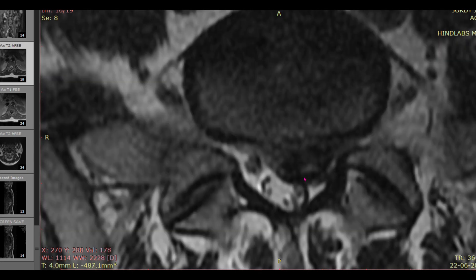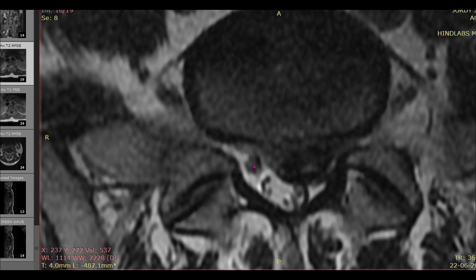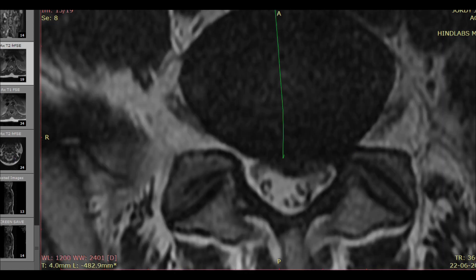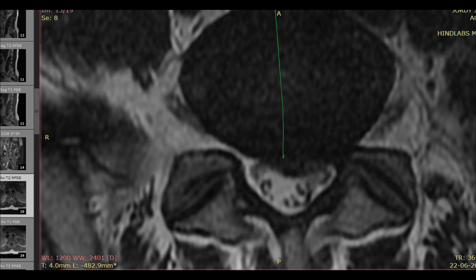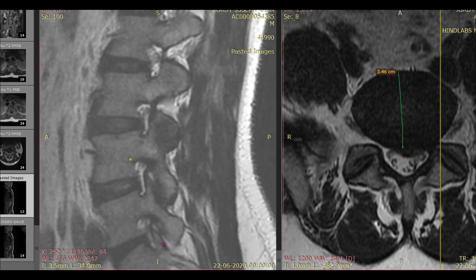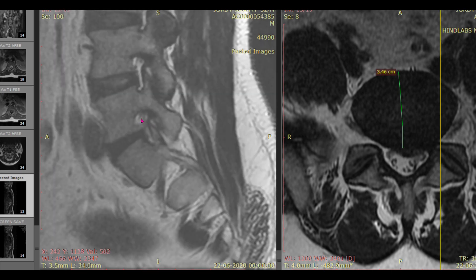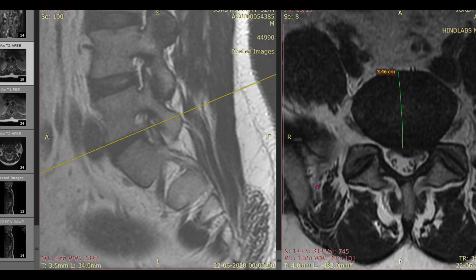At the L5-S1 level, there is a disc protrusion causing severe compression of the traversing nerve root on the left side. You can faintly see the traversing nerve root on the right side as well. The left traversing nerve root is compressed and posteriorly displaced by the disc. For the exiting nerve root, always rely on the sagittal images. In this case, the exiting nerve root on the left side, occupying the upper portion of the foramen, appears to be free and not compressed by the protruded disc.